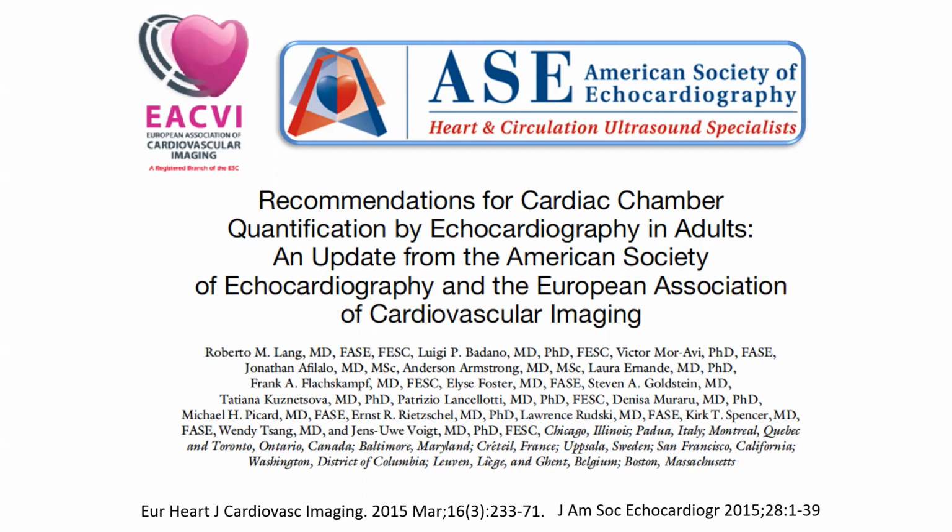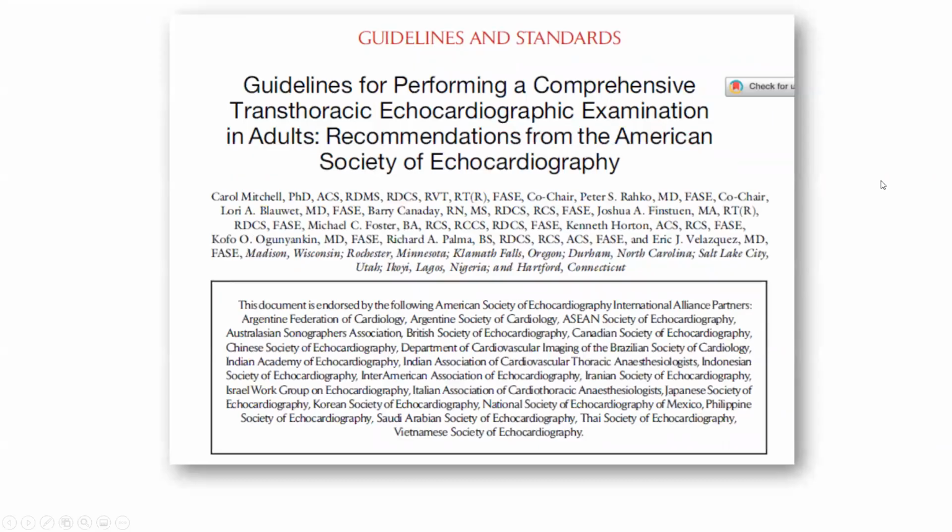I would call your attention to these guidelines, and I think that it is worth reviewing this document as well as this document, which came out approximately 2 years ago, authored by Dr. Carol Mitchell, which is a splendid review of the techniques involved in performing a comprehensive two-dimensional transthoracic echo.